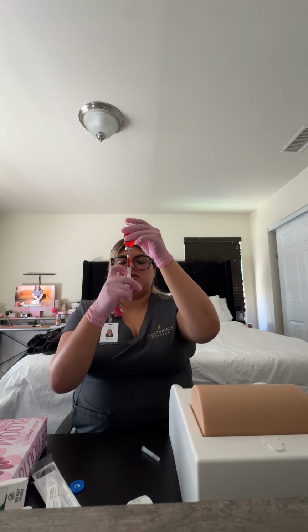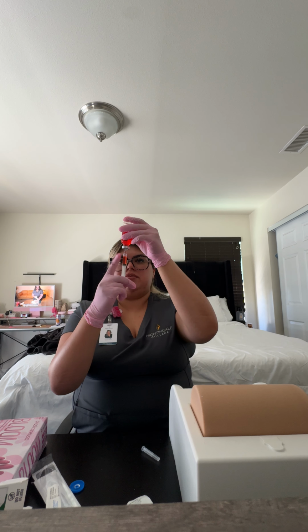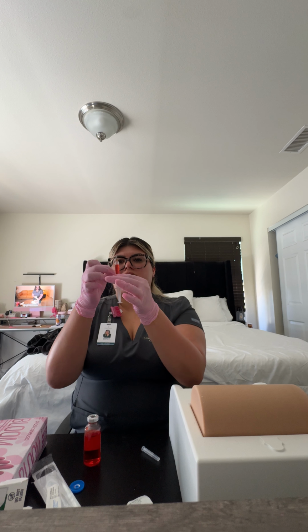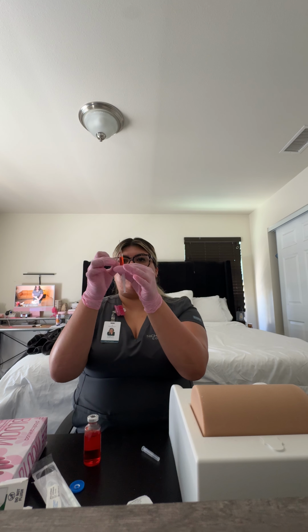And just want to make sure there's no air bubbles. Okay. Make sure we get rid of those air bubbles. Okay, and then we're going to go ahead and cap the needle using the one-hand scoop.